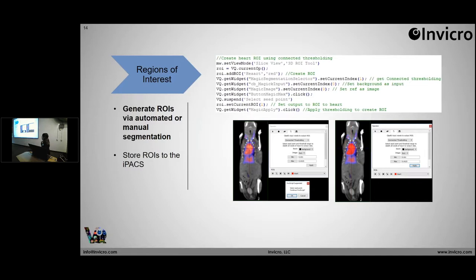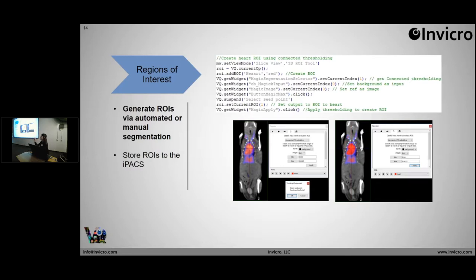To recap: you have your data and you've preprocessed it. Now you actually want to obtain some information from it — generate your ROIs. You can do this through automated or manual ways. I personally like a semi-automatic approach, and VivoScript very easily allows for that by allowing the user to suspend a script, have the user provide input or take some action, and then continue. In this example, the user is prompted to select a seed point — select the center of the ROI — and once you hit OK, it will continue, create the ROI for you, and automatically threshold out the hard ROI. It's good for user interaction where they need to do some manual work, but the script walks you through it.